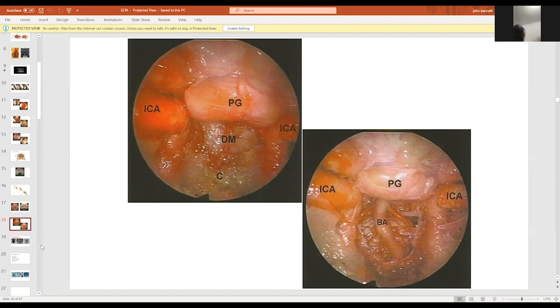Okay, just to show you, if you go forward, this is where you go. But again, when I put my endoscope, I go down first, because if you go down first and you get into the sphenoid sinus, you will have a bunch of bone to drill before getting to the basilar artery. So it gives you much more time to realize that you are going wrong. But if you go too upward, and you miss the pituitary gland, and you drill a little bit the thin shell that makes the planum sphenoidale, you will make an incision there and bam, you have CSF leaks. This is too upward. So it's better to go downward and identify the pituitary gland upward. Okay, next.